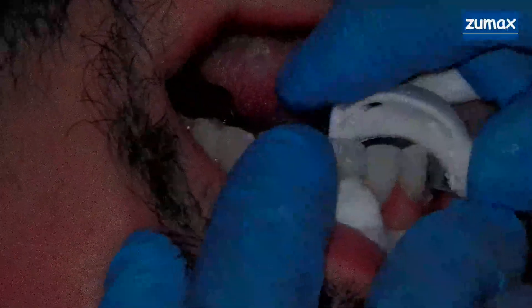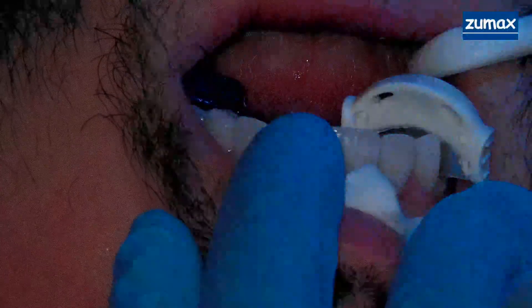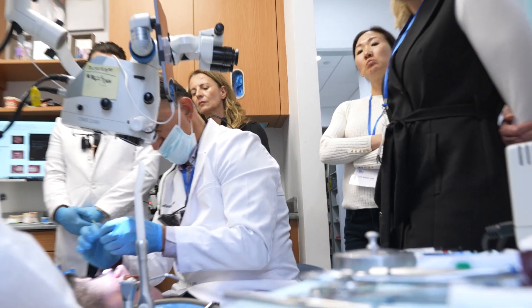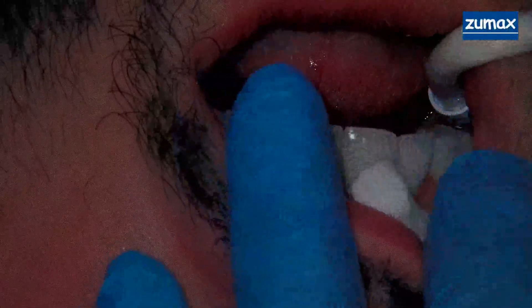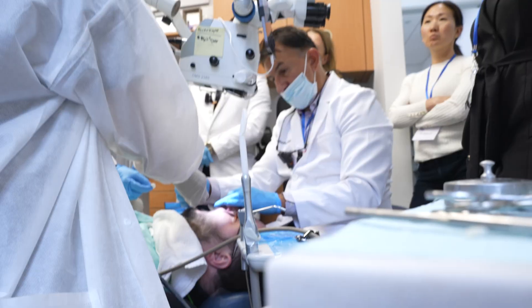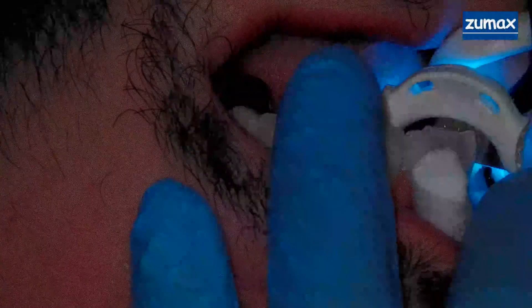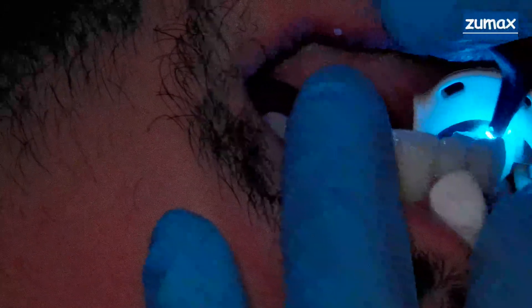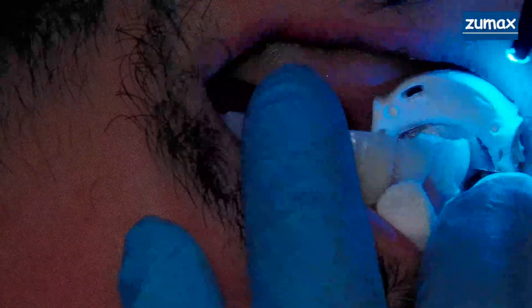Quick strip there. Hit it. Lingual on the canine. Premolar. One more stripper — the white one. Should have two out ready. I need a third one. I go premolar, light tack. Then on the back premolar and one more in the back. See how the cement is really sticking on the premolars. I'm going to do that again because I don't trust that the tacking light went in between. I go back again, tack it again, tack the last one again, all the way out.